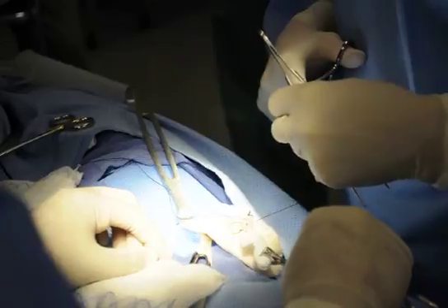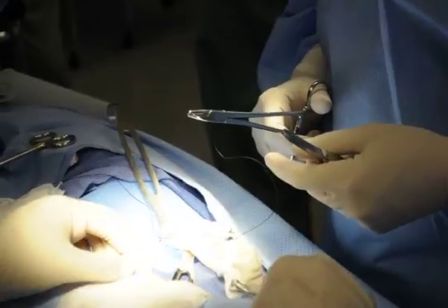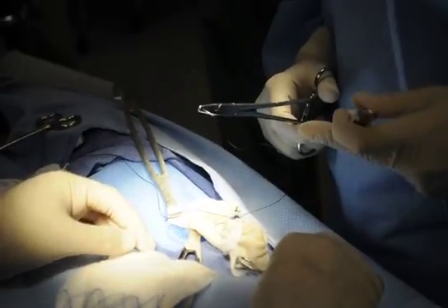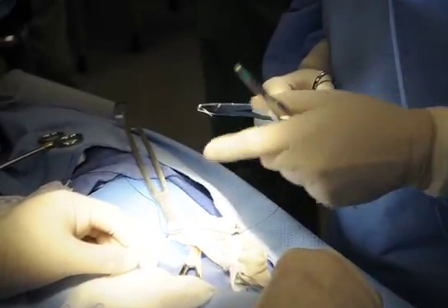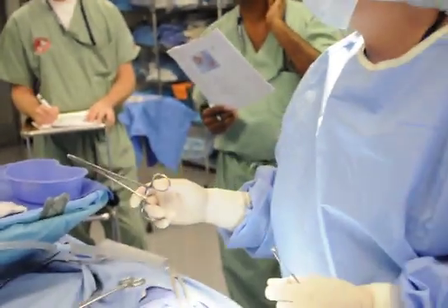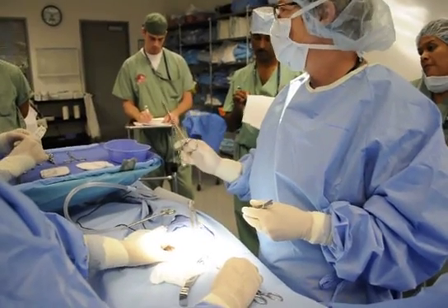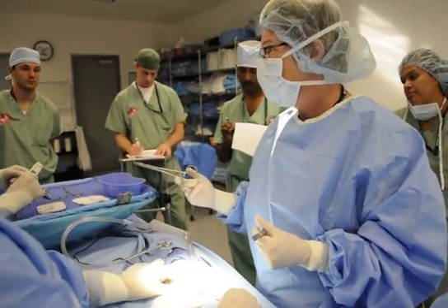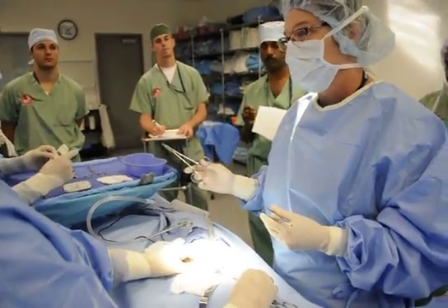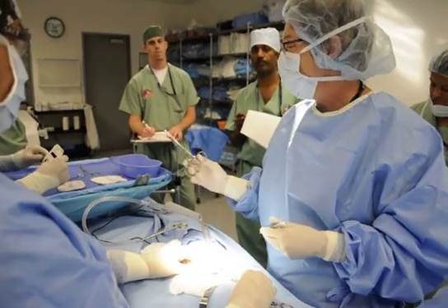Did you notice what kind of needle, what kind of suture this is? It says right on there — it's silk. It's also a control release. You should always note when you have a control release. If your surgeon is expecting one that is not, and you give him one, you tell him — because if he pulls too hard on that, he's going to disengage his needle. And if he's doing a purse string, he's going to be upset at you because you didn't tell him.